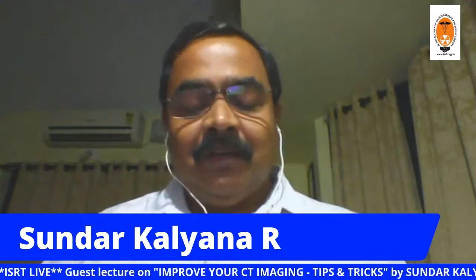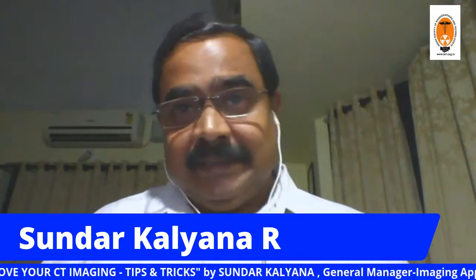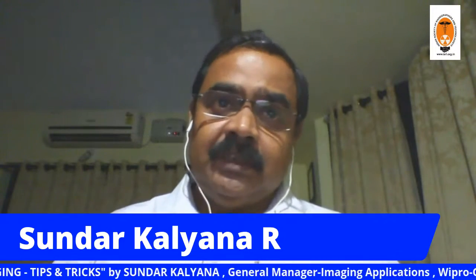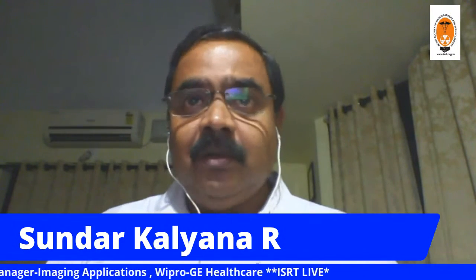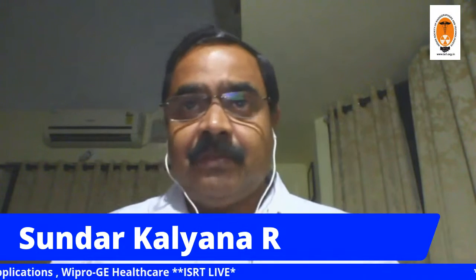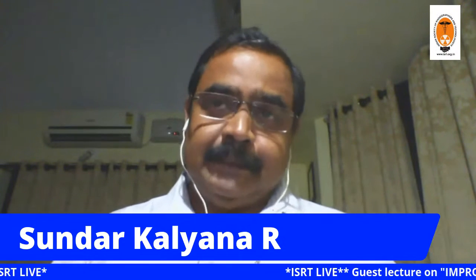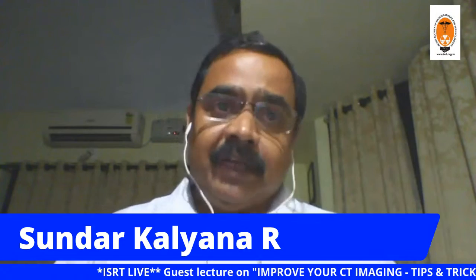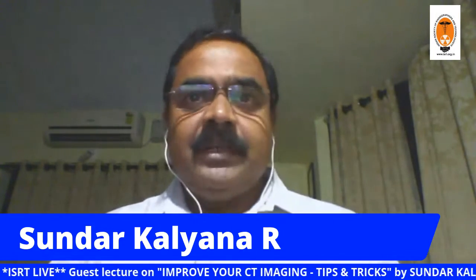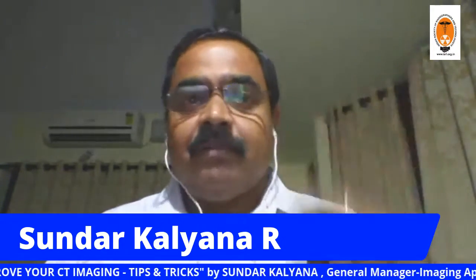So Jai, we are not comparing conventional radiography with the CT. In CT, dose is measured as a standard at 120 kV and 100 mA, and this value is measured using a phantom, which is a 16 centimeter phantom for the head and a 32 centimeter phantom for the body, and this is taken as a dose index. If you increase the kV, the photon flux will increase. If the photon flux increases, proportionately the attenuation will increase. That means absorbed dose inside the phantom will also increase.